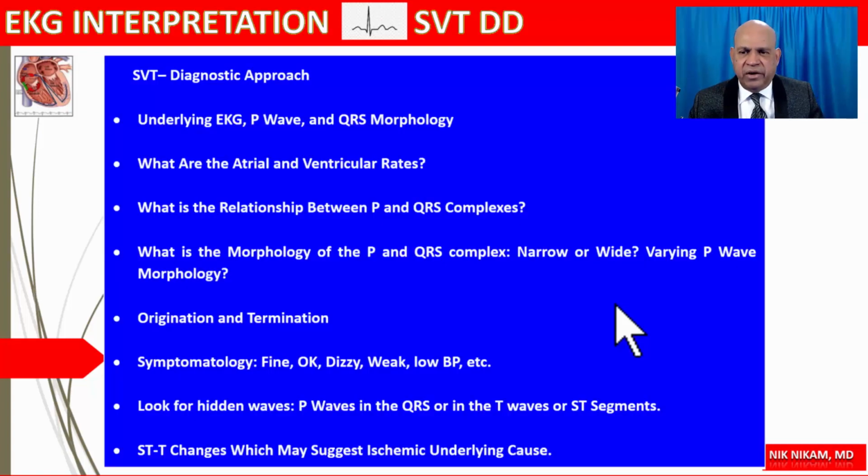In all this presentation, I would say this is the most important slide that you want to remember for the rest of your life. This is the foundation based upon which you try to systematically analyze a given EKG or a rhythm strip to arrive at the most logical conclusion as to what type of supraventricular arrhythmia we are dealing with. Where does it arise and what does it mean? How do we differentiate between supraventricular tachycardia with wide QRS complexes and ventricular tachycardia?